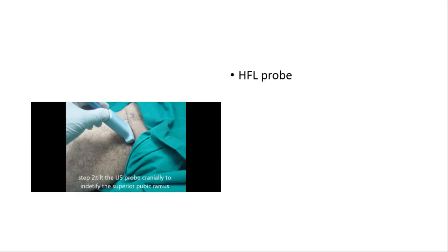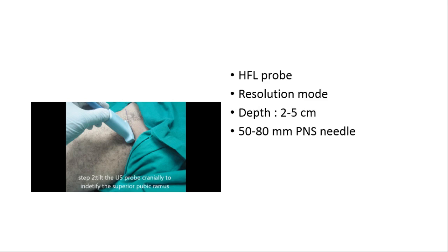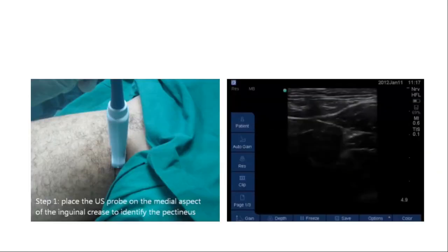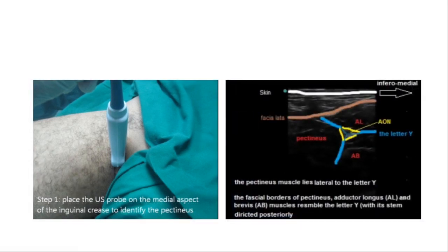The third approach is at the level of the inguinal crease, with the most important target being the pectineus muscle. Place the probe on the inguinal crease, identify the femoral vessels, then go slightly medially to find the pectineus. At this point, tilt the probe 30 degrees cranially to identify the superior pubic ramus. Settings remain the same — high-frequency linear probe, depth 2 to 5 cm, 50 to 80 mm PNS needle, in-plane lateral to medial. Local anesthetic required is 10 ml of half-concentration lidocaine as a single-point injection covering both divisions.